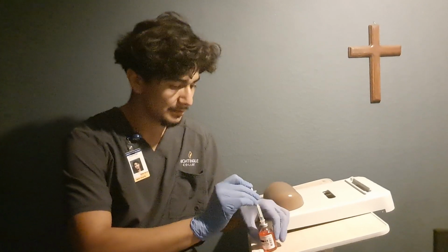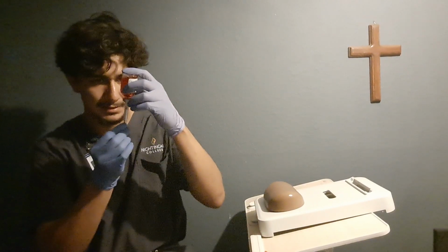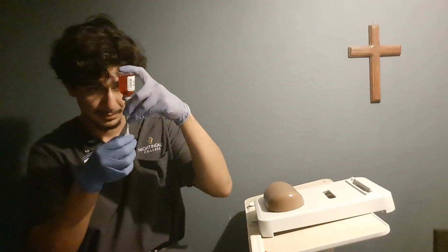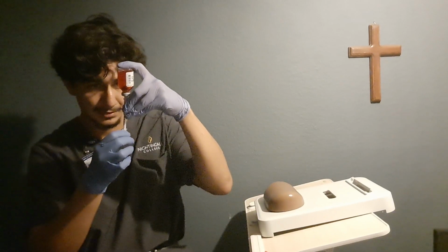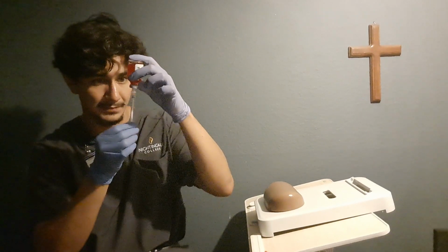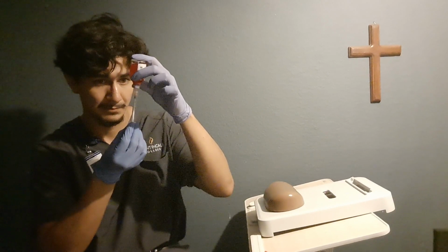Once we've injected it, we're going to go ahead and flip it upside down. And then to prevent any bubbles, we can flick the syringe. And if there's too much air in the syringe, we can reinsert the solution and re-withdraw the medication.